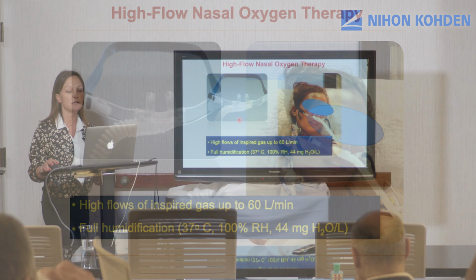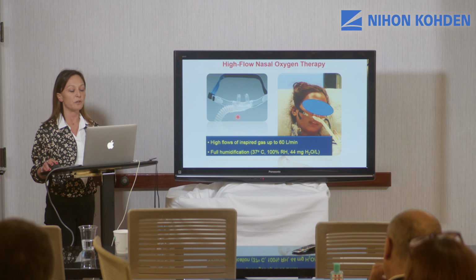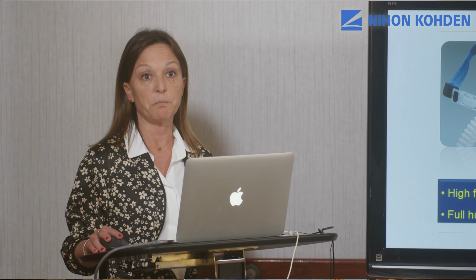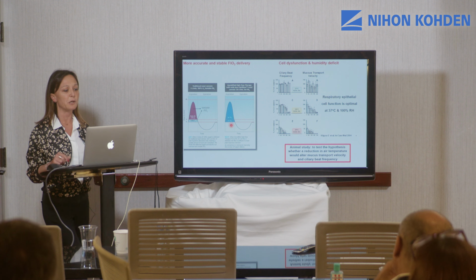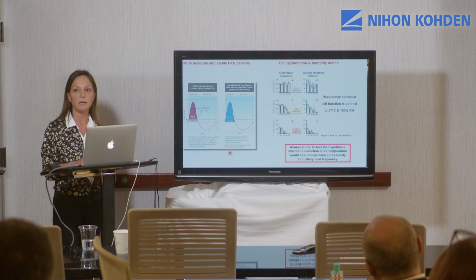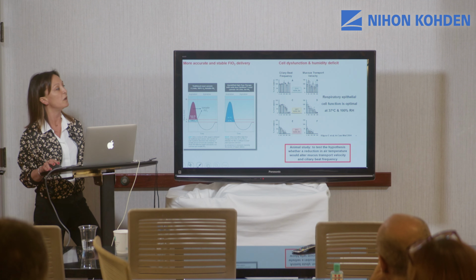And we have the chance to heat the flow, so we have high temperature and high level of humidity, and the temperature is around 37 Celsius degrees. So high-flow nasal cannula became, in particular during the pandemic, one of the first line of treatments in patients affected by acute respiratory failure. But I would like to focus a little bit on some physiological effects that make this O2 therapy completely different from the traditional oxygen therapy administered with the Venturi mask. But these physiological effects are again different also from the physiological effect that we can reach with non-invasive ventilation.